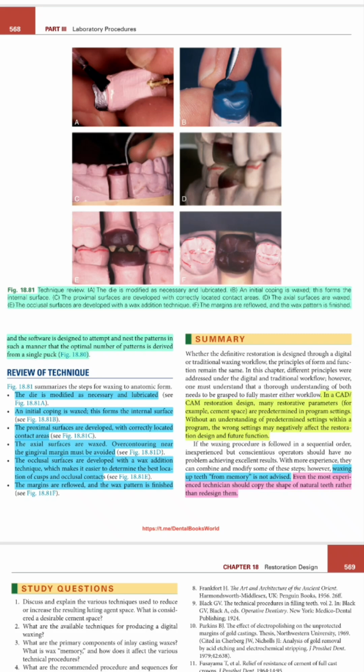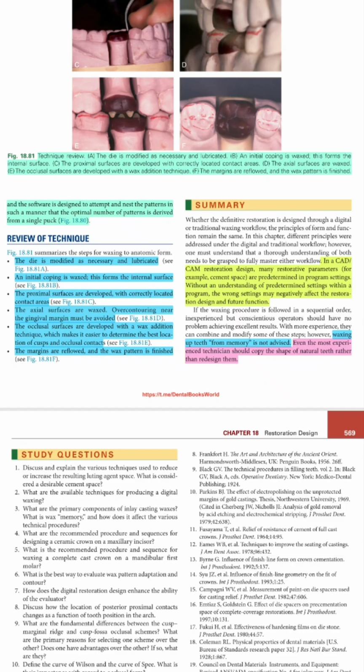are developed, then the axial surfaces are waxed, then the occlusal surfaces are developed. Waxing up teeth from memory is not advised. Even the most experienced technicians should copy the shape of natural teeth rather than redesigning them.